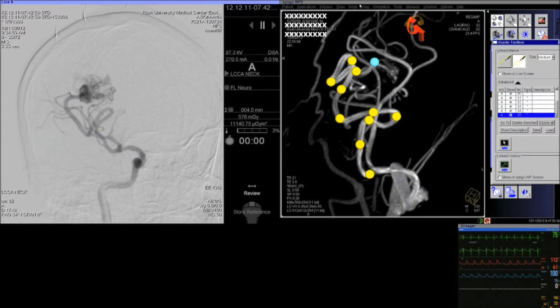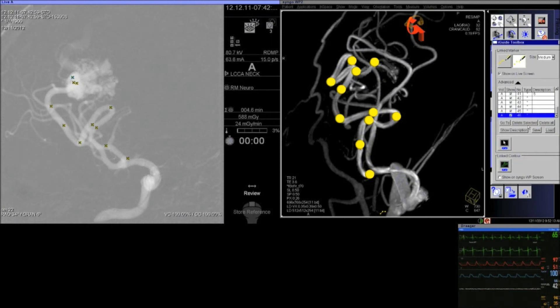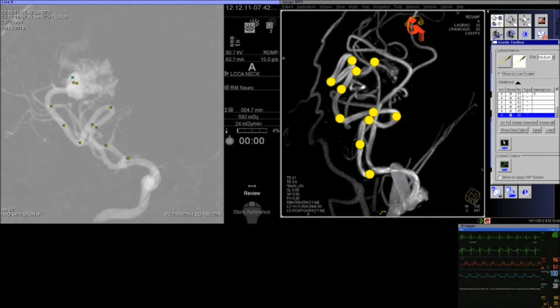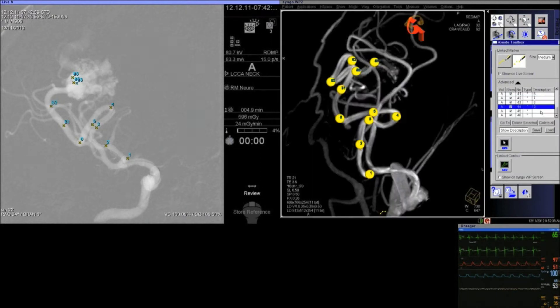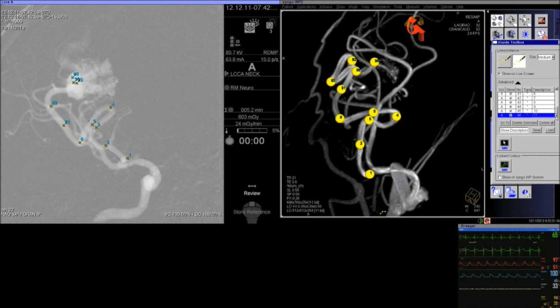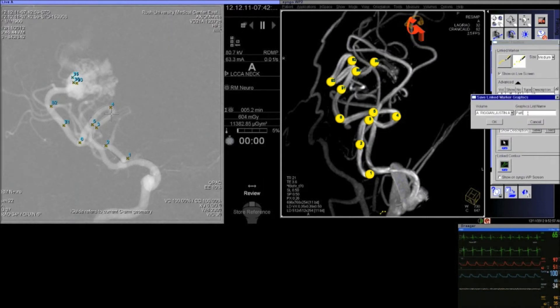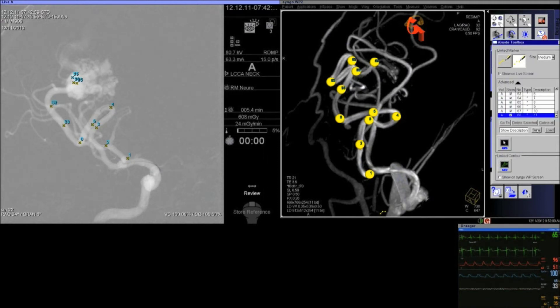This will superimpose on your roadmap and allow you to have a highlighted path for your microcatheter. In this case, we chose to use a Marathon microcatheter and a Mirage microwire. As you can see, coming around the bend on this vessel, we had a little difficulty following our plan — we catheterized a vessel and passage there — but you can clearly identify that and reroute because of the pre-planned trajectory.